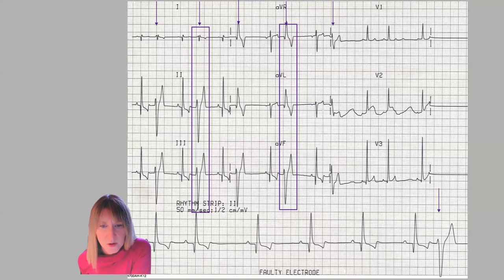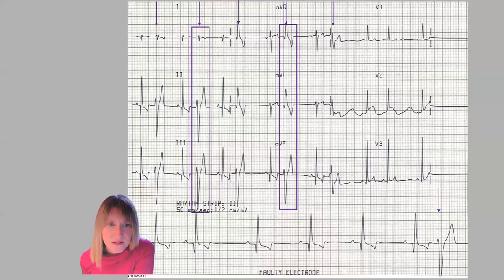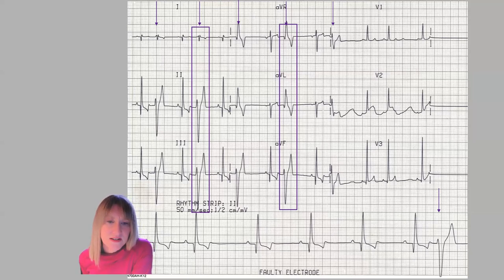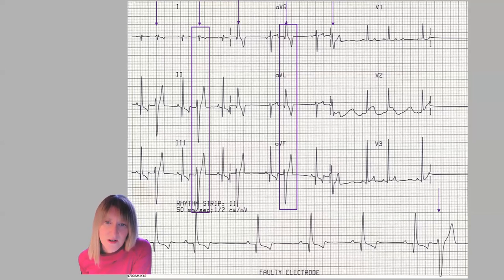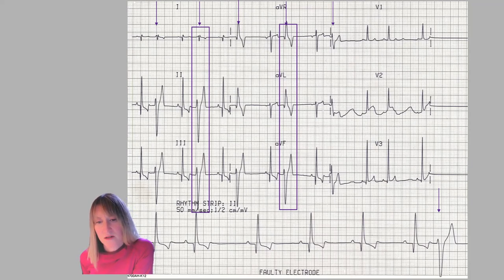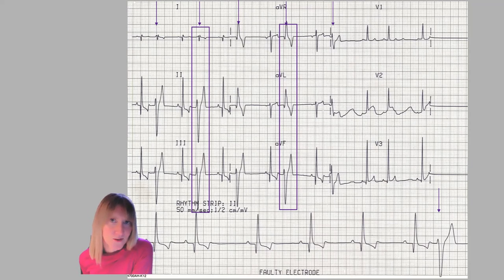In my next example from a golden retriever, I've got arrows pointing to the PVCs along the top, and a box around a couple of examples of PVCs showing what they look like in leads one, two, three, and AVR, AVL, and AVF. We have lead two along the bottom again. What I notice here is that the PVCs have a QRS orientation that is largely opposite to the normal sinus beats — the heartbeats immediately to the left or right of the boxes. So assuming my MEA is normal for the sinus beats, which I can confirm it is, these PVCs may have originated in the left, traveling roughly left to right, opposite to what the sinus beats did.